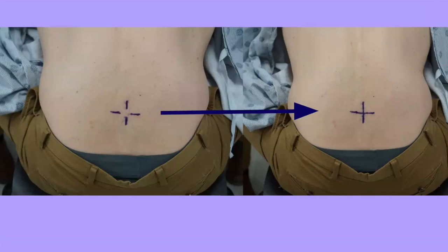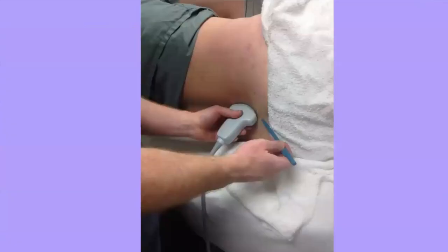As a note, because we're not doing every procedure with the patient sitting up, you can also do this with the patient lying down. Finding your midline, finding your depth for the ligamentum flavum for how far the needle needs to go, and also making sure that you're in between the spinous processes.